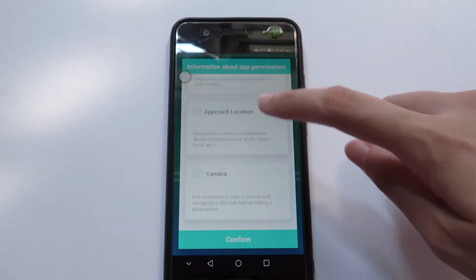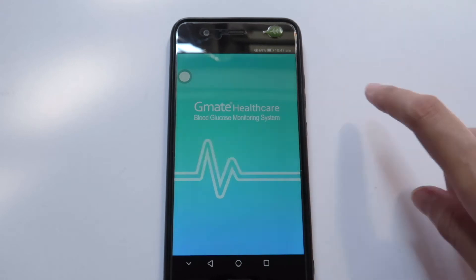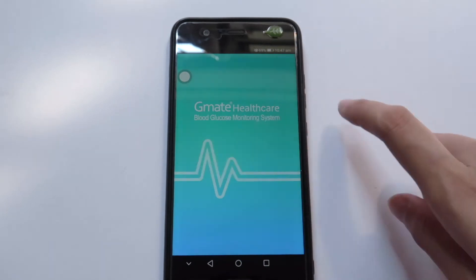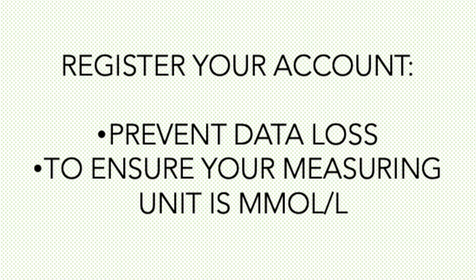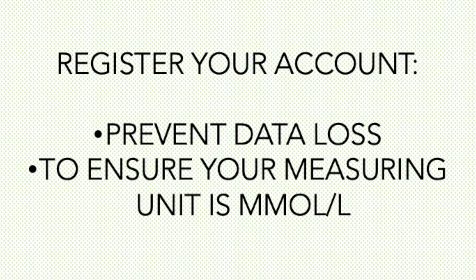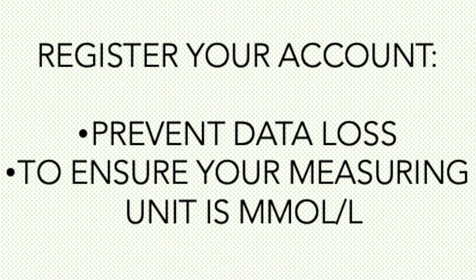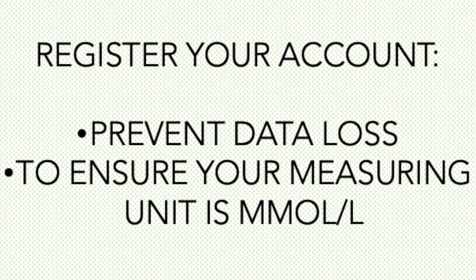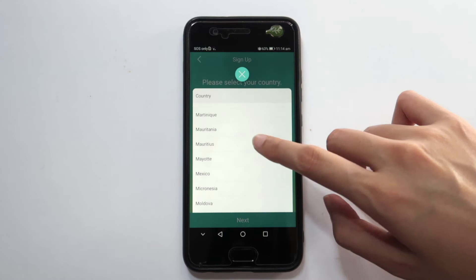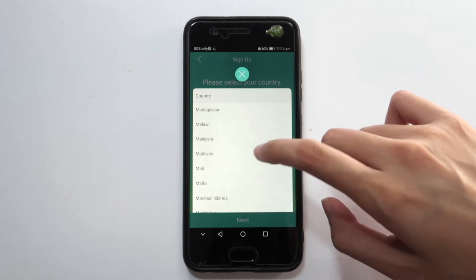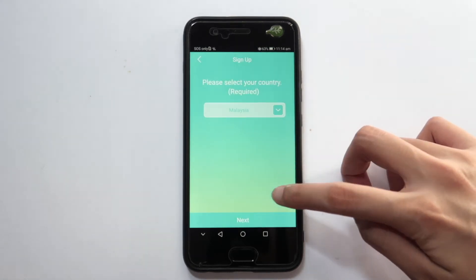Confirm and allow all permissions requested. Registering your account is necessary to avoid data loss and also to maintain your measuring unit at mmol per litre. Click on Sign Up to register your account and you will see Malaysia as your default country. Otherwise, please choose Malaysia and click Next.